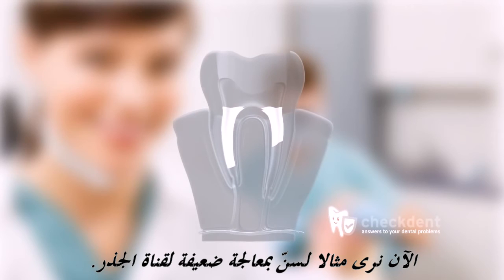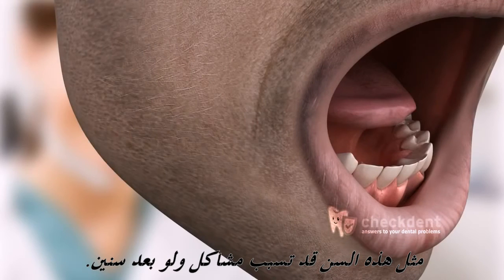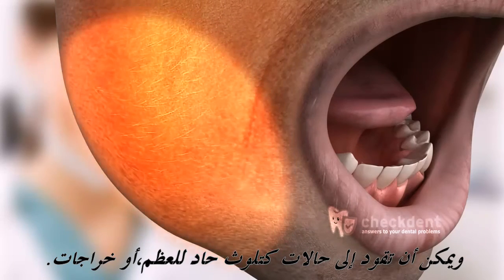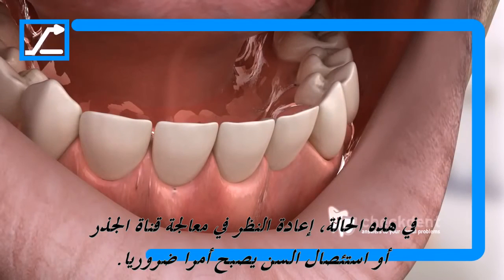Now we see an example of a tooth with a poorly performed root canal. The anterior root is not filled at all, while the posterior root is only half filled. Such teeth can cause trouble even after many years and can lead to conditions like acute bone infection or abscesses. In this case, a revision of the root canal treatment and/or tooth extraction becomes necessary.